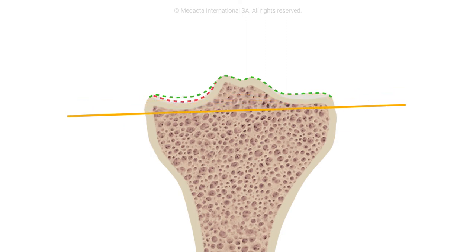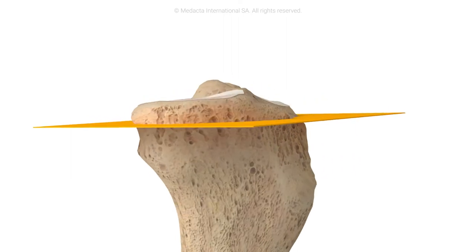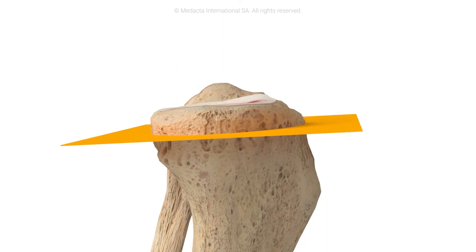A symmetric cut is performed on the medial and lateral sides, restoring the native slope and cutting exactly the implant thickness.